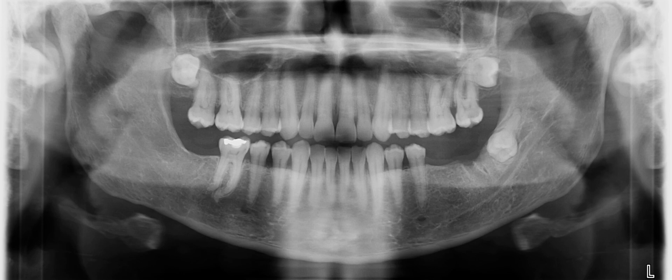Hi everyone, just wanted to quickly share an interesting radiograph that came across my desk today. What you're seeing is a panoramic radiograph of a 36-year-old patient with impacted third molars. It's not every day that you see all three impacted third molars, and the extent and angulation of impaction in this particular case is not always common, so I want you to see this one.